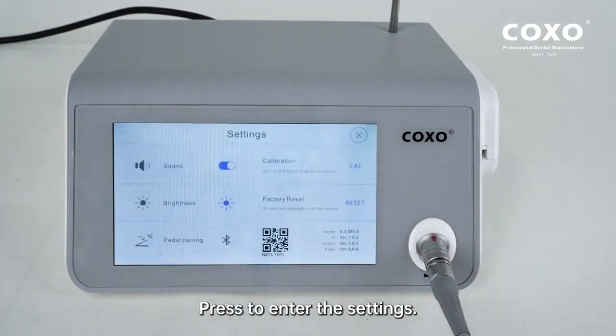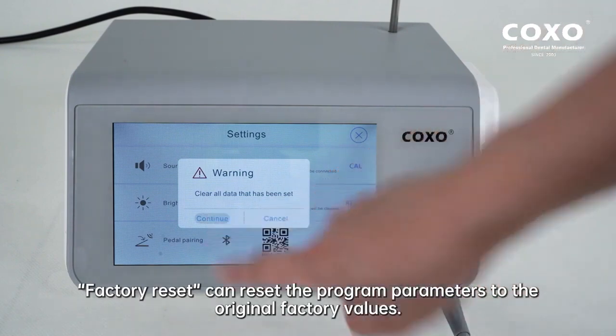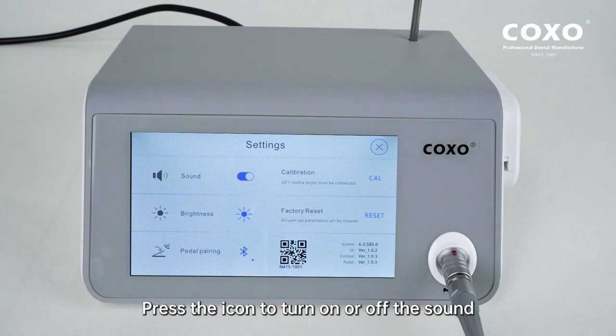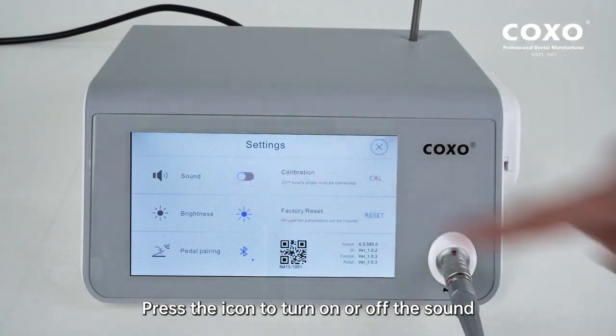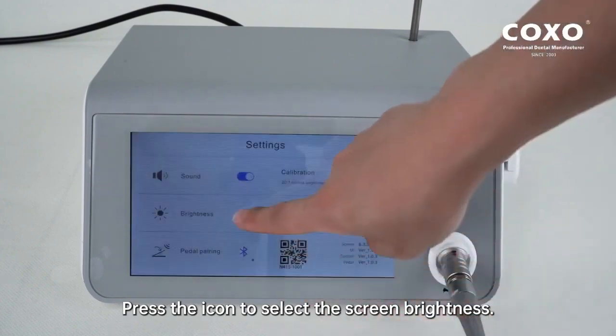Press to enter the settings. Factory Reset can reset the program parameters to the original factory values. Press the icon to turn on or off the sound. Press the icon to select the screen brightness.